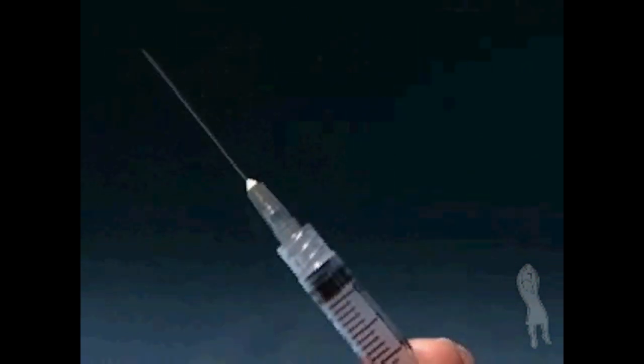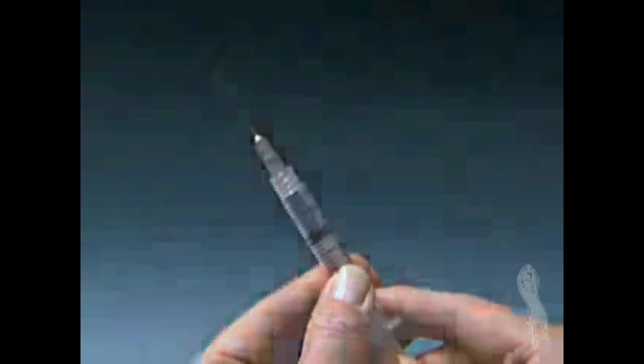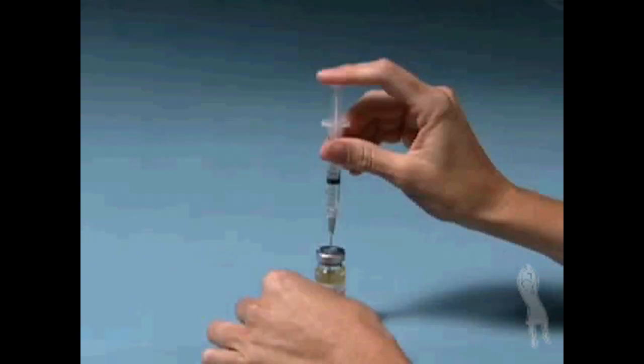Remove the wrapping from the syringe and carefully pull or twist off the needle cap. Draw air into the syringe by pulling back the plunger as far as needed to withdraw the milliliter/cc dose of progesterone in oil that you've been instructed to take. Place the vial on a hard, flat surface and carefully insert the needle through the marked center circle of the rubber stopper.